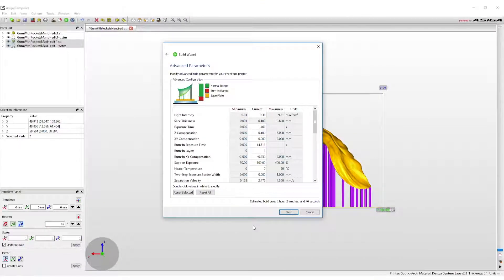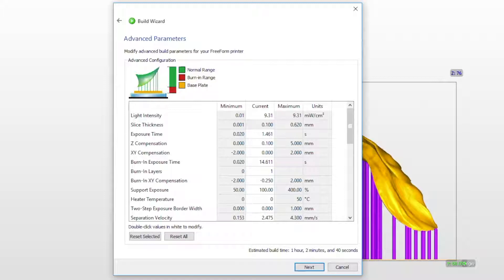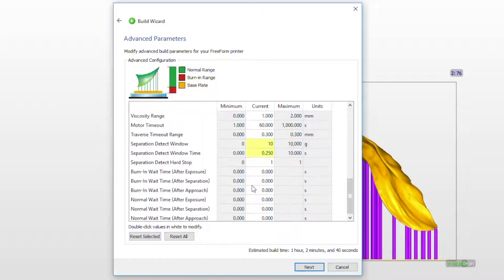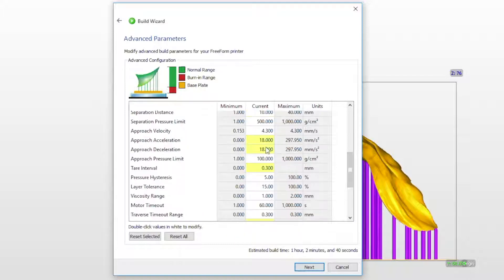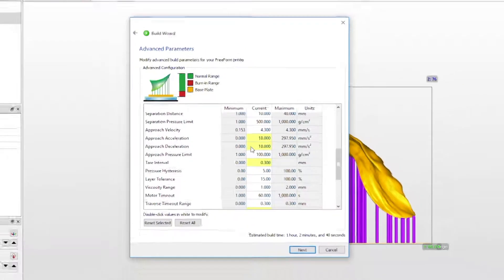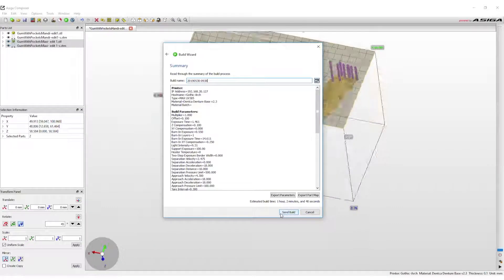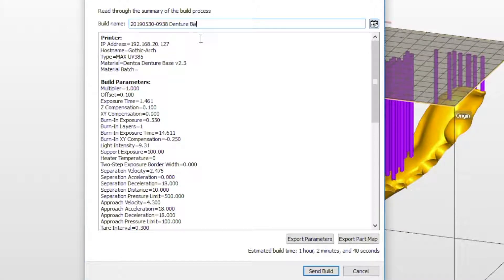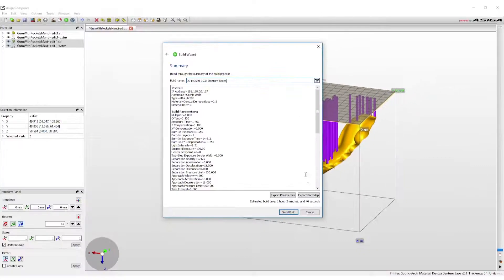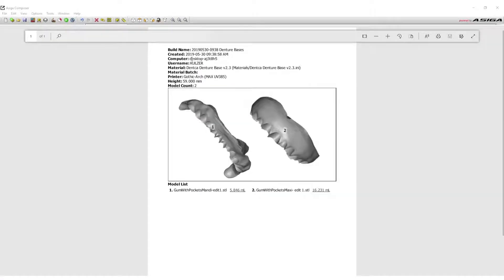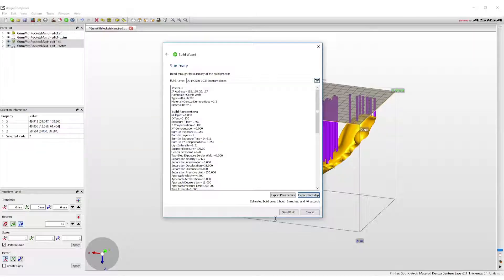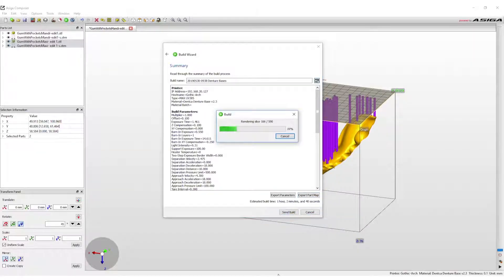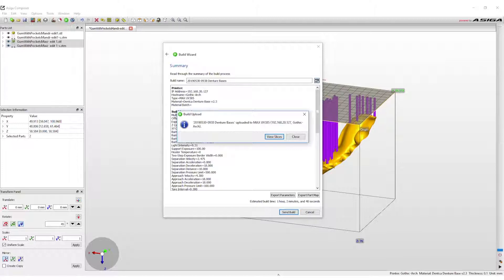The advanced parameters window will open, allowing the user to make changes to any aspect of the print. The numbers highlighted in yellow indicate that Fast Print Mode is activated. These settings will normally never have to be changed. After selecting Next again, a summary page of the print will appear. On this page, the print job can be named — the default name will be the time and date of the print. This page also has the option to export the part map, which is a PDF document summarizing the current print job. Finally, click Send Build. The computer will now take the three-dimensional images, create them into slices or layers, and submit those layers to the printer.